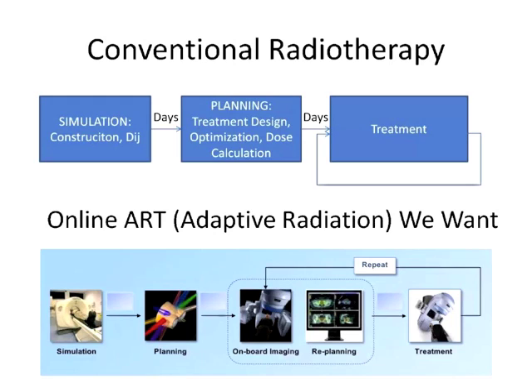To do that, we have to accelerate the tools that we have before. If we can accelerate the simulation tools or planning tools, we can save lots of time for the patients, instead of waiting days for the patient's tumor to be simulated or planned. We can accelerate the treatment process much faster.